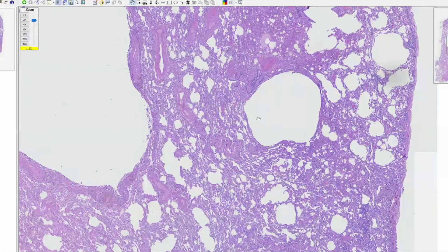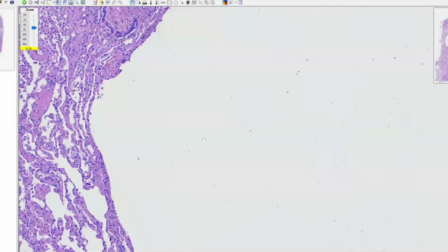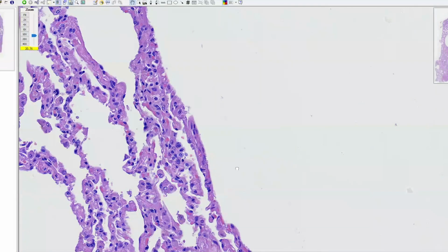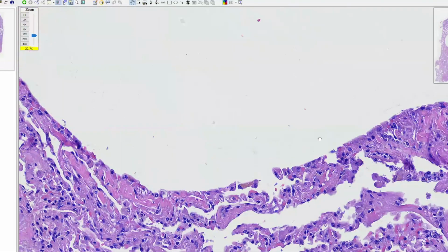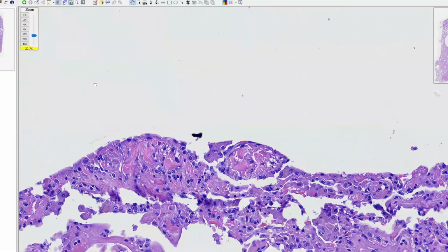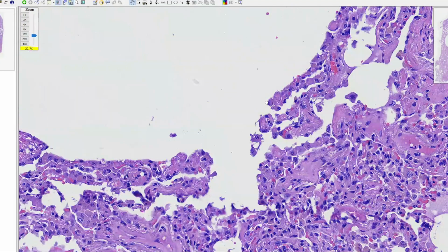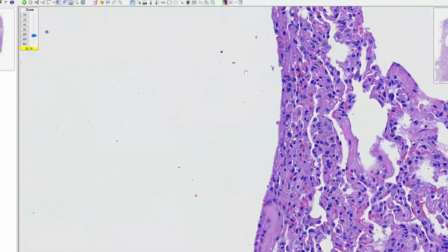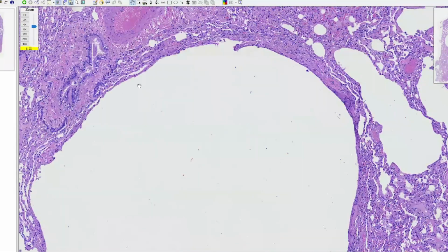So moving on to our next case here, we once again have these cystic areas. So we see the cysts throughout this lung parenchyma. When we're looking at the walls of the cyst, we're really not seeing the smooth muscle proliferation or nodules or anything that we saw last time in the case of LAM. And we're not really seeing much in terms of smoking-related changes. Maybe a few pigmented alveolar macrophages, not a ton. And this doesn't really have the appearance of emphysema.